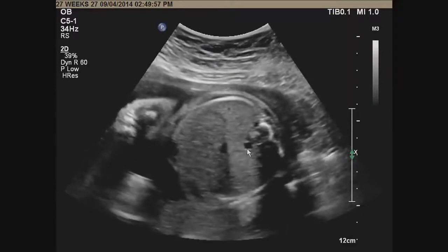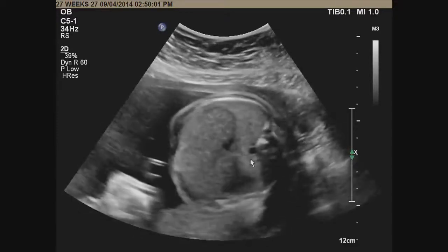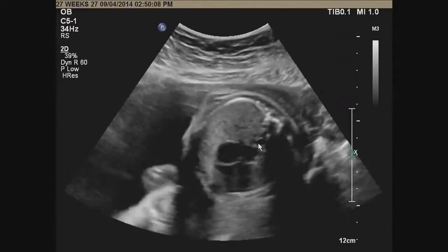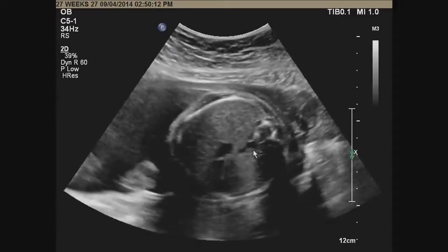And I also look at the descending aorta, a very important part. We'll talk about this when we talk about aortic arch abnormalities. You see, if I bisect that chest into two halves, that descending aorta is on the left side. So that's a left aortic arch, a normal aortic arch.